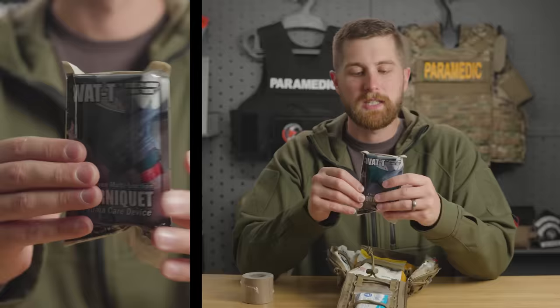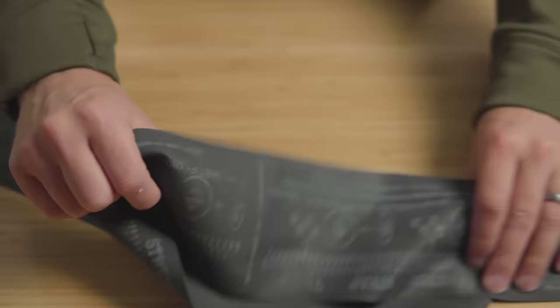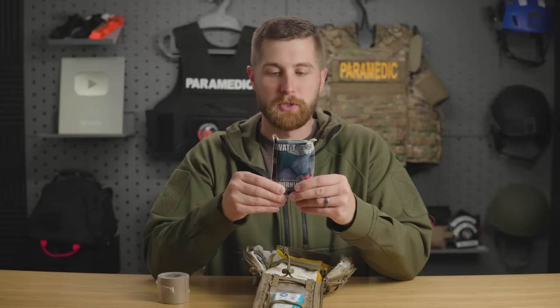And it just takes a little bit more cognitive thought to get it on somebody, which is why it's not TCCC approved. But the reason I like this over something, say the RATS, is that it's really wide. So your occlusion pressures are lower. It doesn't cause as much pain putting it on the patient. And this can double as a pressure bandage. It can be used to hold packing gauze in a junctional site. You name it, this is going to work for it. It also works for lashing things. It's a very multi-purpose tool, and I really like that they put it in here.